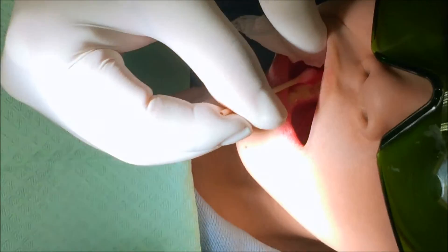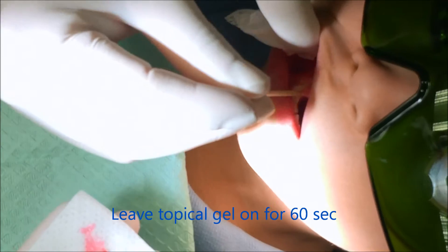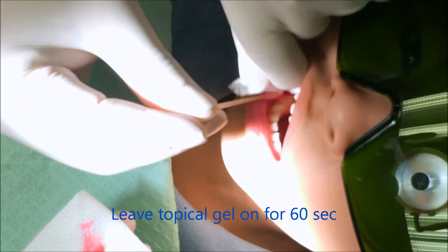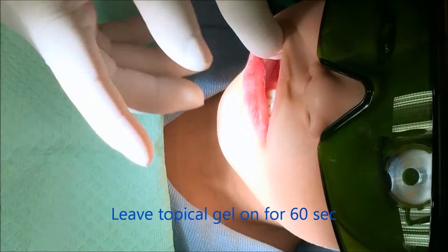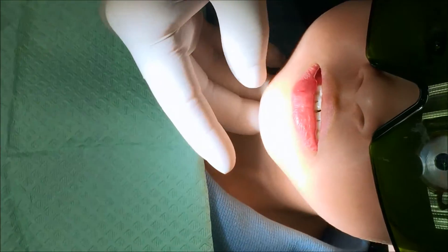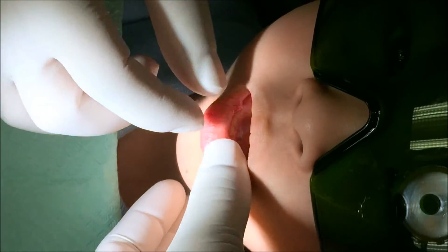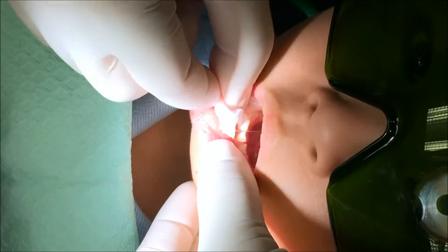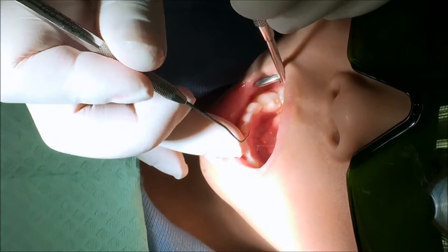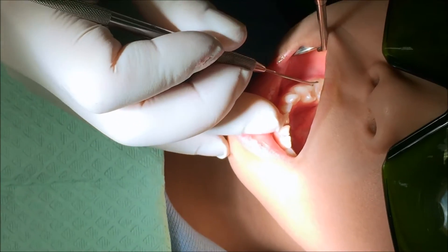We have strawberry jelly here and it's gonna stay here for a minute, and then I'll wipe up the extras. Open for me a little bit, sweetie — go ahead and bite down, perfect. We're gonna wait for about a minute. Okay, I'm gonna wipe up the jelly now. Let me get that towel and we'll wipe up all the jelly. Let me check — make sure we don't have big chunks of the jelly here. Perfect.